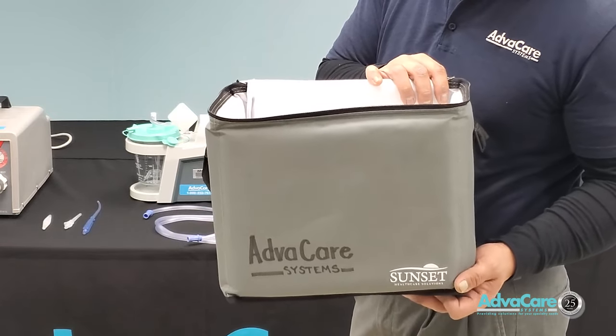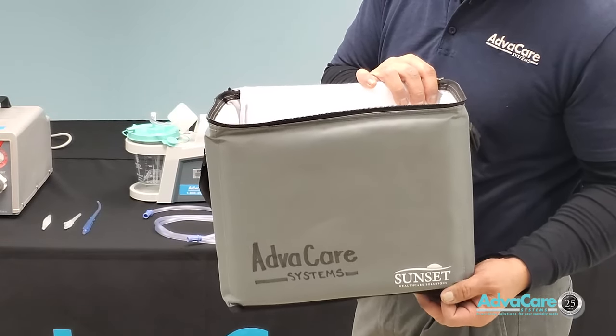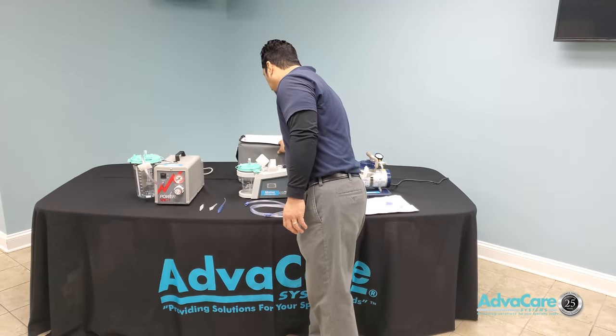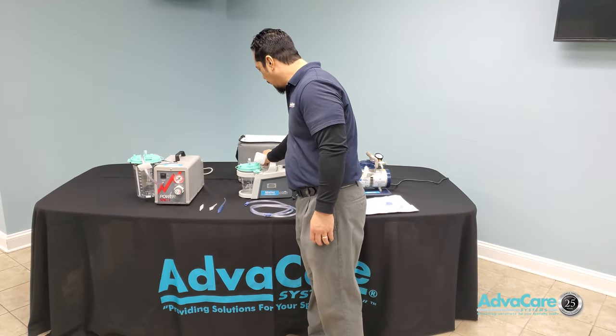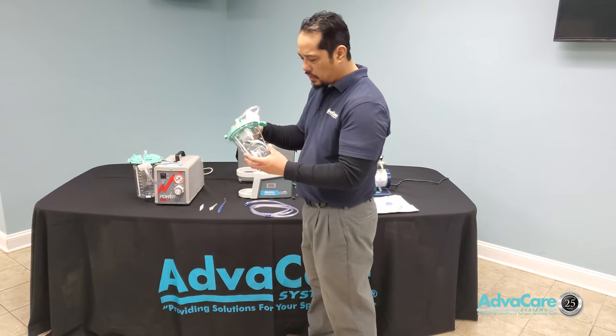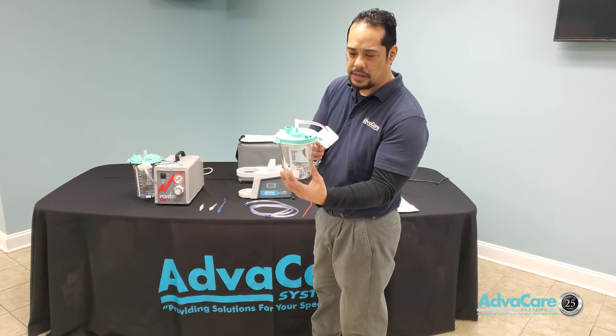It also comes with a carry case or carry bag to allow you to be more discreet when carrying the portable suction machine. It uses the same type of collection canister as the stationary suction machine — the 800 cc canister.